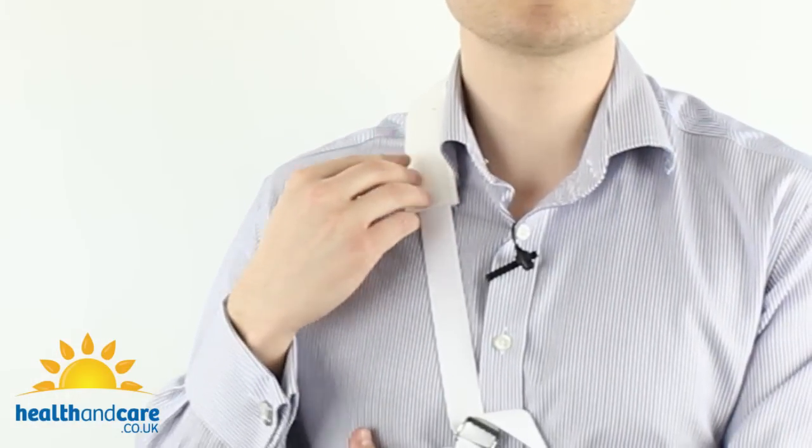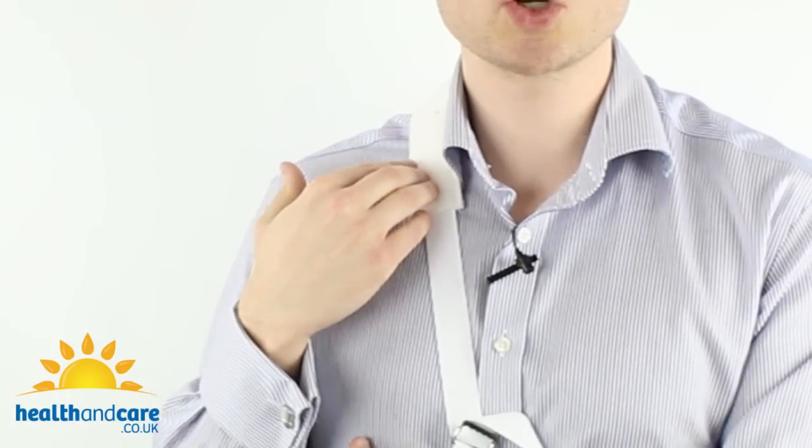The strap on the Cotton Arm Sling also has a moveable pad, so it's incredibly comfortable across the neck and the shoulder area.